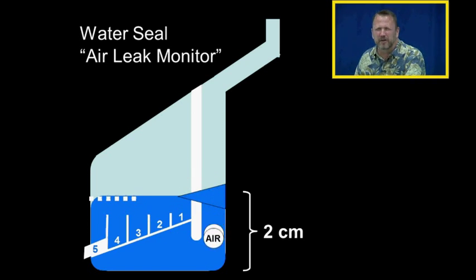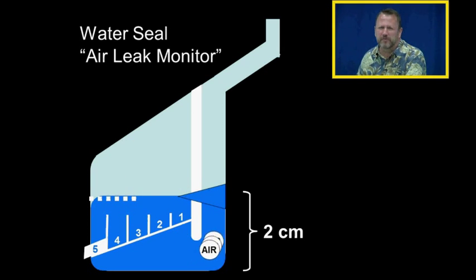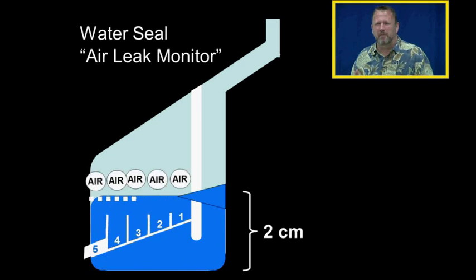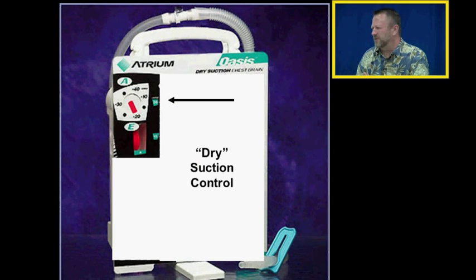With more air coming through the water seal, we'll see the air come up through the second column. With even more air, it will come up through the third column, then the fourth, and even the fifth column. With the graduated air leak monitor, we can evaluate qualitatively how much air is coming from the system by seeing whether it bubbles through one, two, or more of the columns.